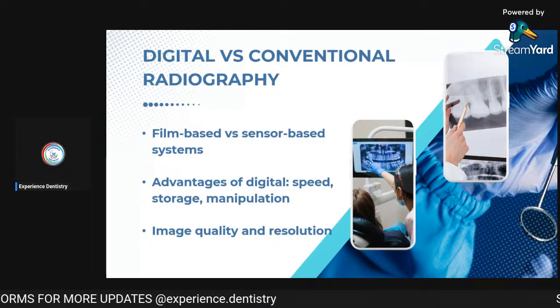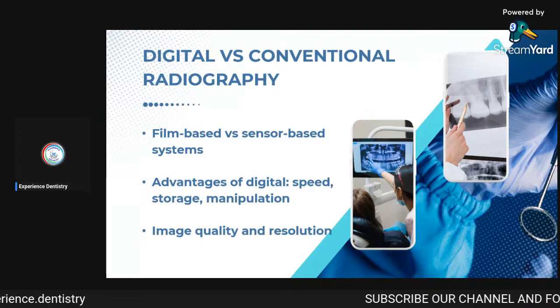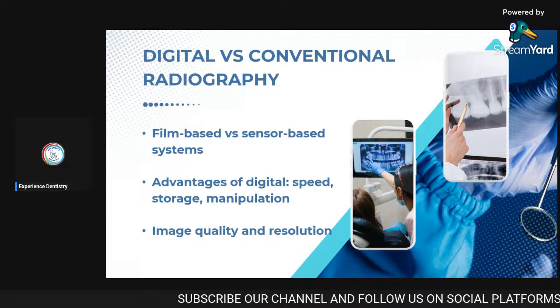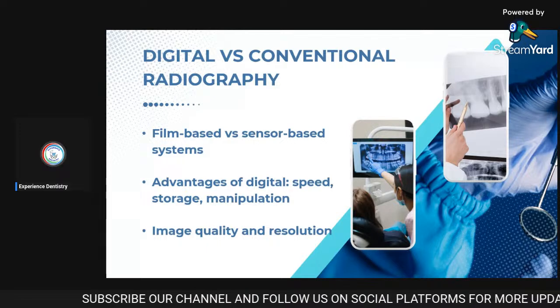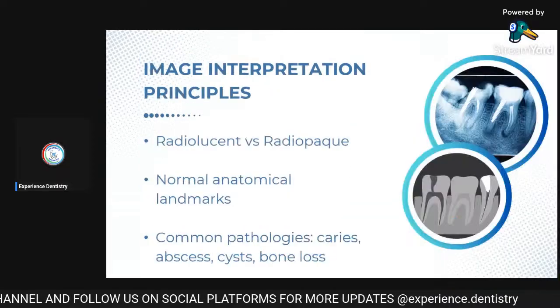You can store it in digital format and you can manipulate it as well. Like you can make a display case of it and you can also teach your patients with it. And the digital one basically has good image quality and resolution as compared to the film-based one.